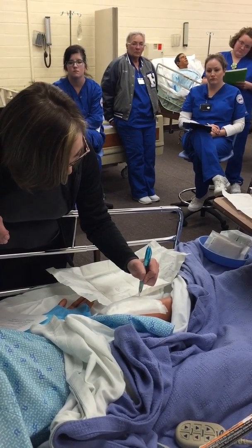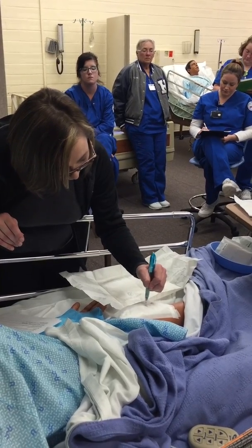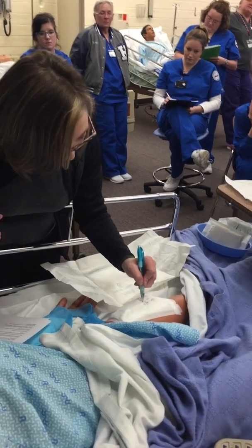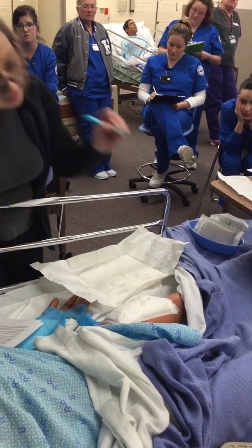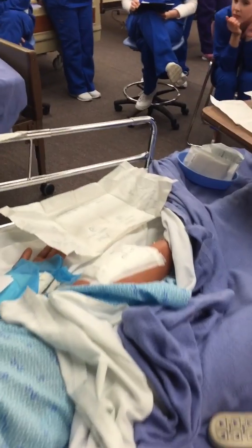And what's the date today? 27. I'm going to put 2/27/16. I'm going to put the time. We'll say 1645. And then I'm going to put my initials on there. Initial. And that's it. Date, time, initials.